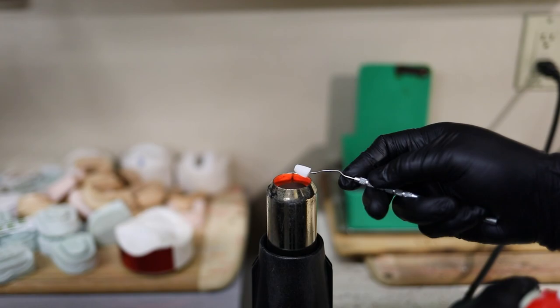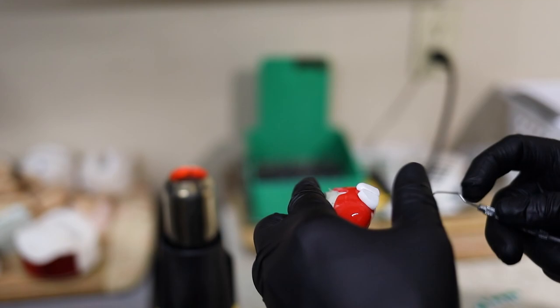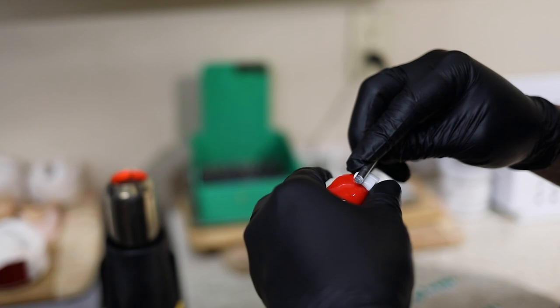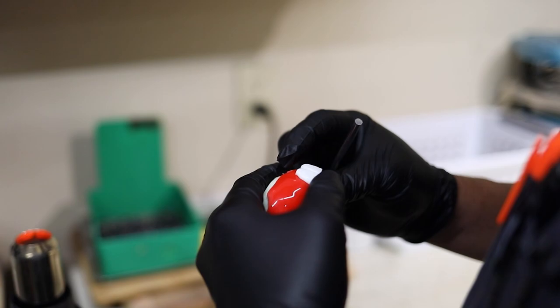He kind of melts the plastic a little bit. And when you melt the plastic, it adheres to the plastic he's applying it to. And see how he's kind of smashing it, kind of makes the teeth a little bit bigger. And so this is kind of where the artistry comes in from Vic's side, is that he smashes it to the size of what he thinks the actual person's teeth are, so it looks more natural.